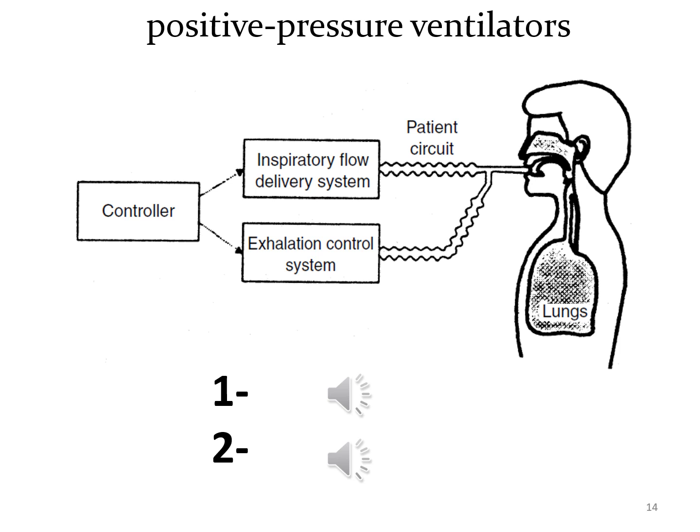The use of a positive pressure gradient in creating the flow allows treatment of patients with high lung resistance and low compliance.